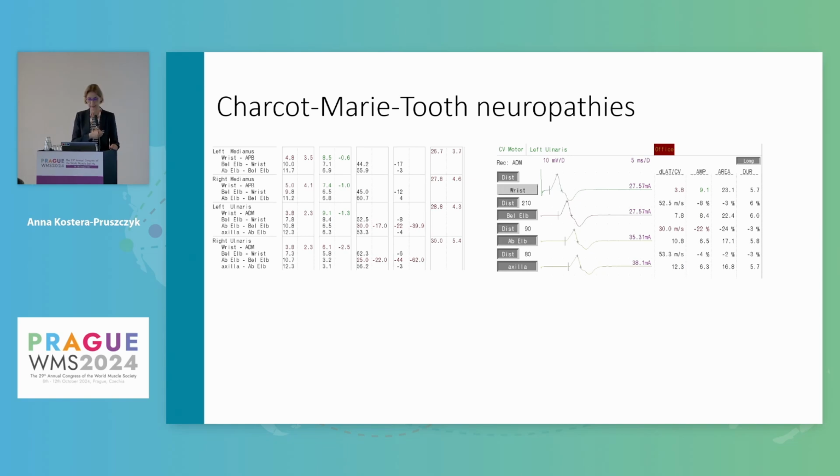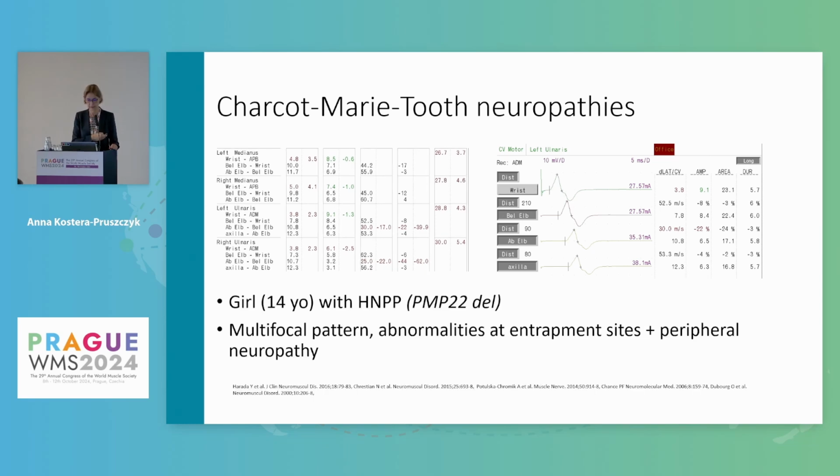Again, another example of the nerve conduction studies performed this time in a girl with brief story of fluctuating peripheral weakness, mostly on the ulnar side, and that's a classical pattern that we see in hereditary neuropathy with pressure palsies, but the preliminary diagnosis for the girl was in fact CIDP.